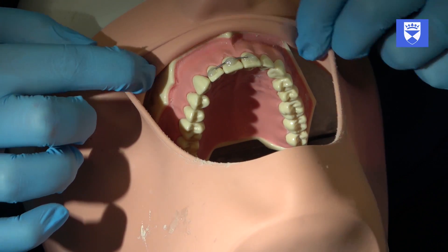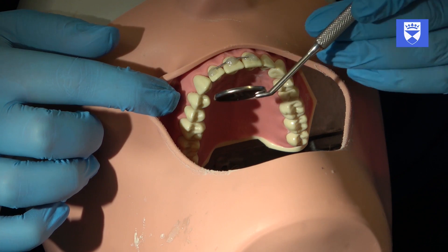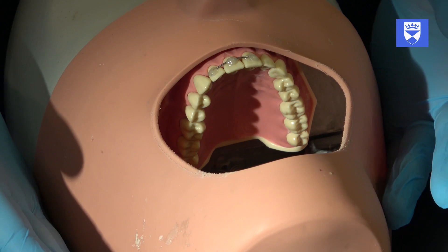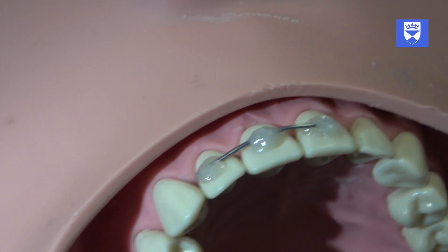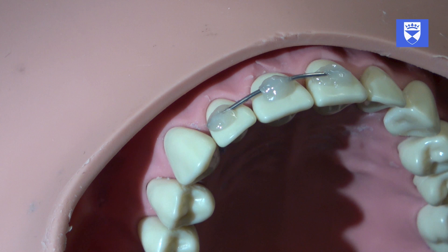Using a composite color that is much darker or much lighter than the tooth surface is also a good idea. This will help when removing any residual composite at the splint removal procedure, which will be covered in another video.